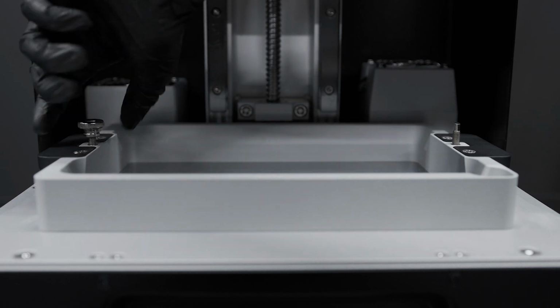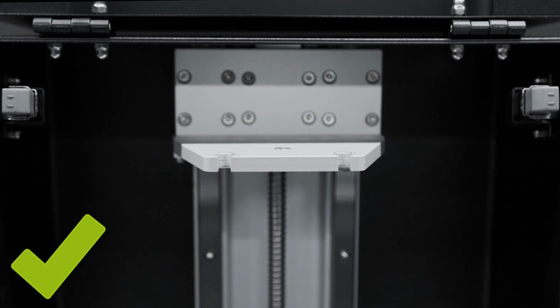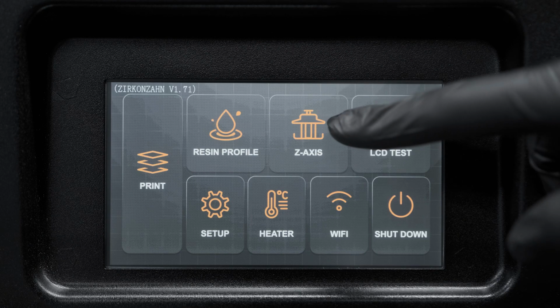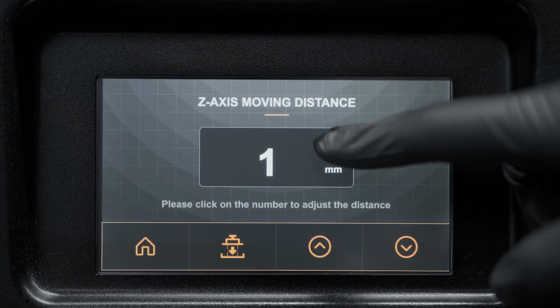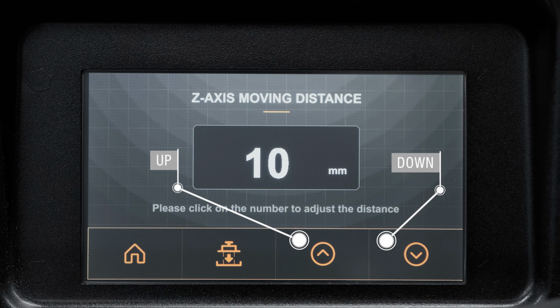After you have removed the building plate and the resin vat, make sure the Z-axis reaches the top completely. If it has not, select Z-axis and set the number shown on the touch panel to 10 mm. Then, press the arrow to move the Z-axis up.